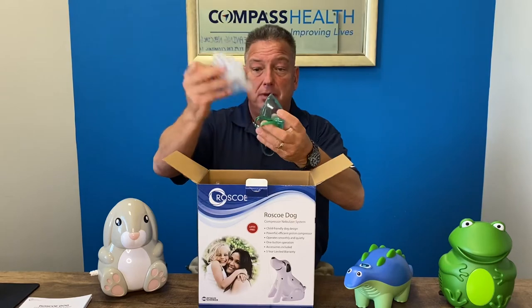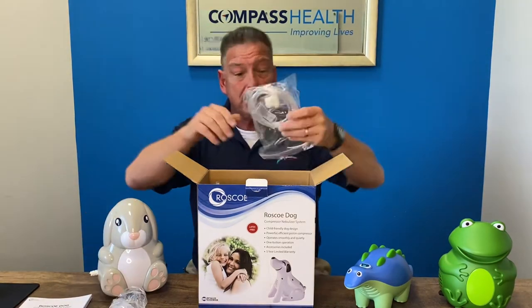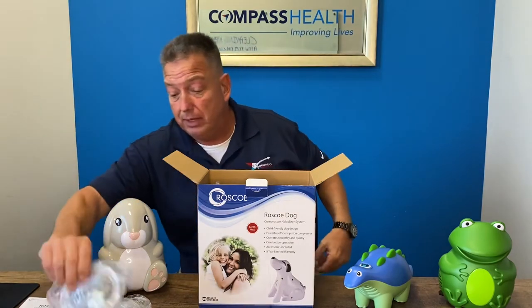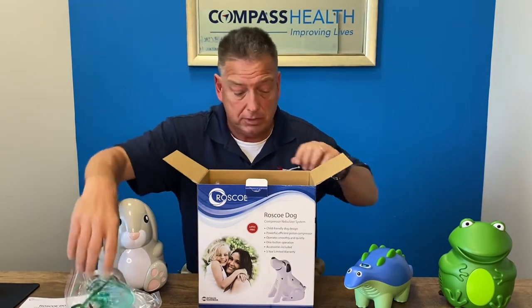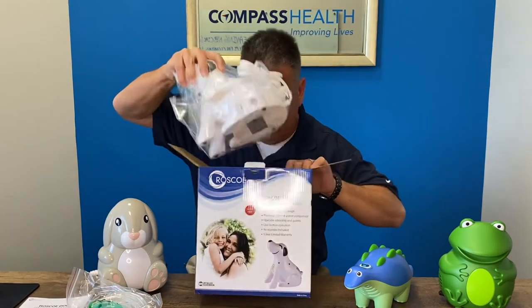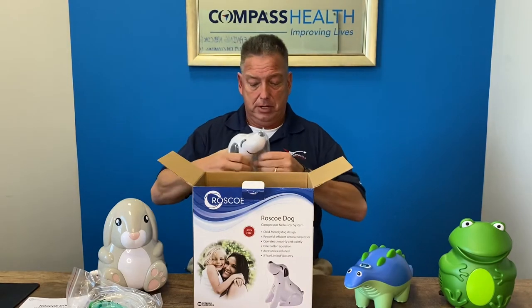The top layer will give you a protective piece for shipping and transit so the product arrives in good condition. We have the medicine cup and a pediatric mask, since these products are designed for children. They do include a pediatric aerosol mask at no additional cost.